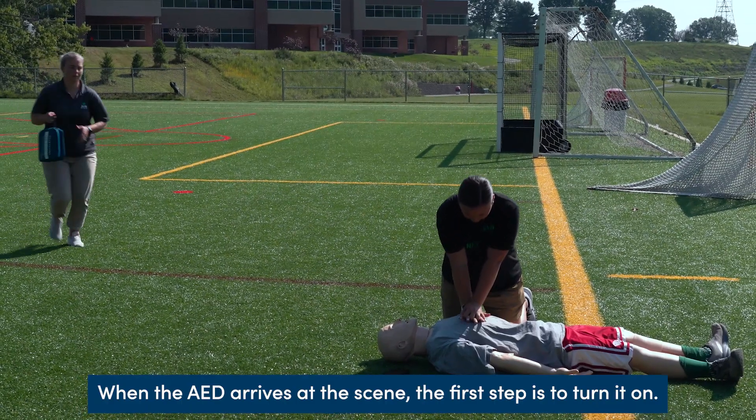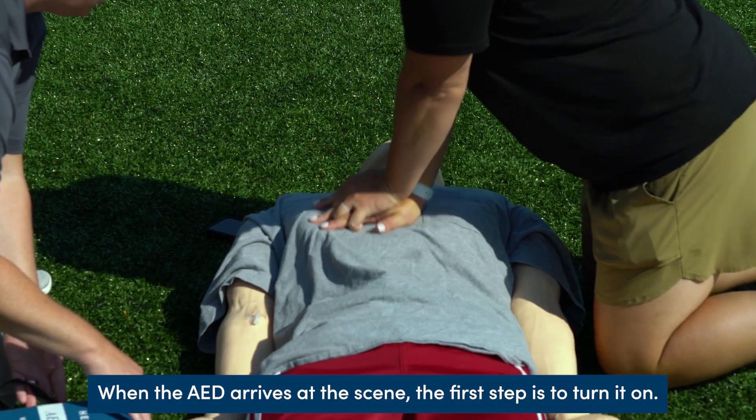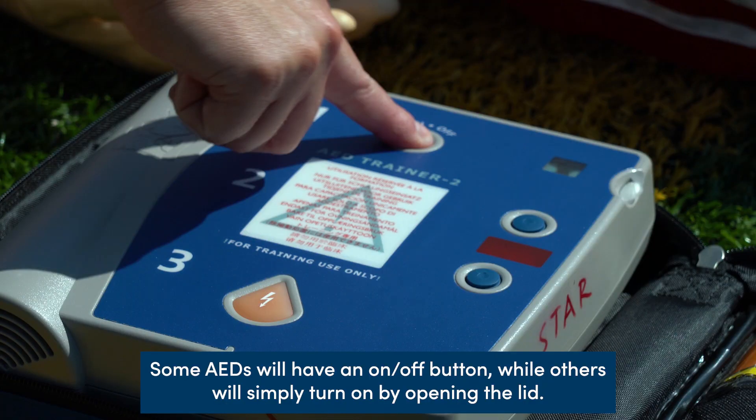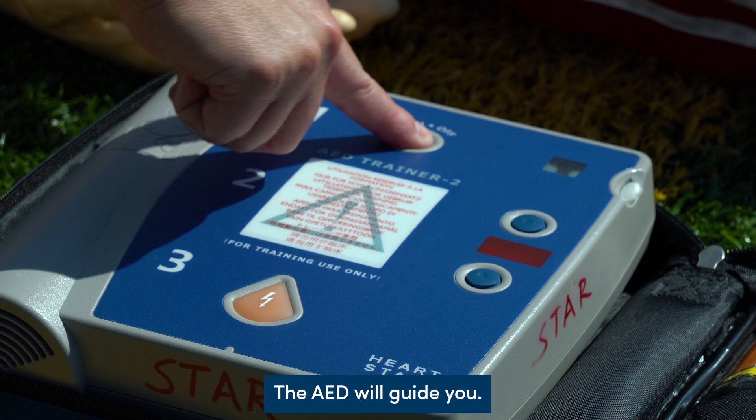When the AED arrives at the scene, the first step is to turn it on. Some AEDs will have an on-off button, while others will simply turn on by opening the lid. Once the AED is turned on, be sure to follow all directions — the AED will guide you.